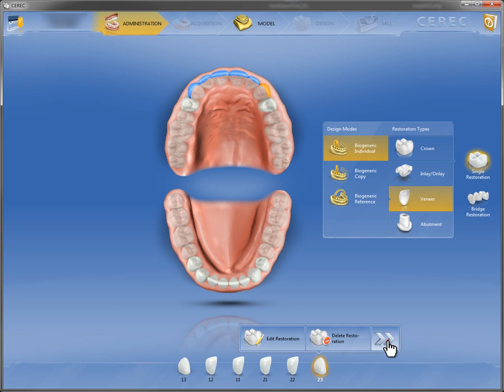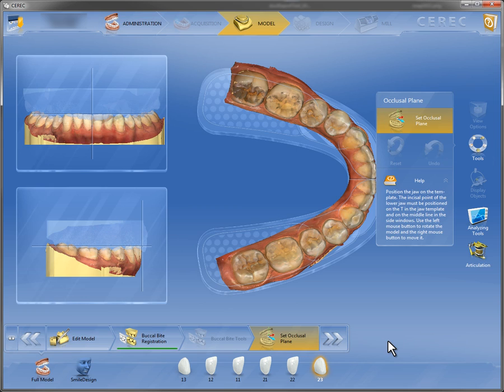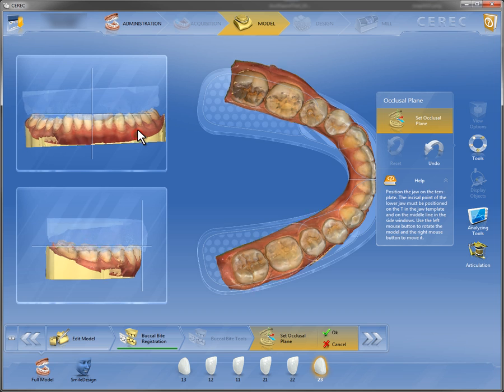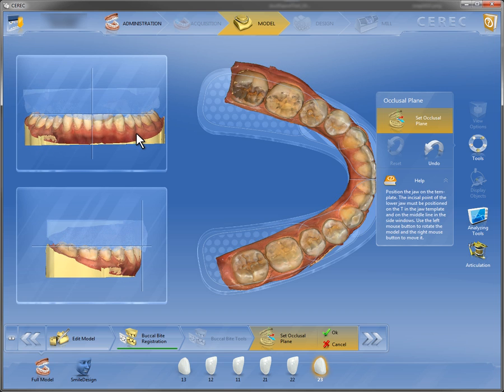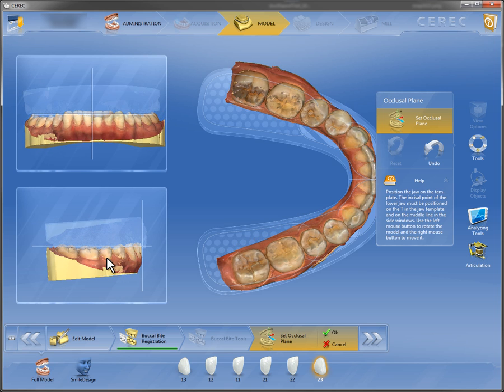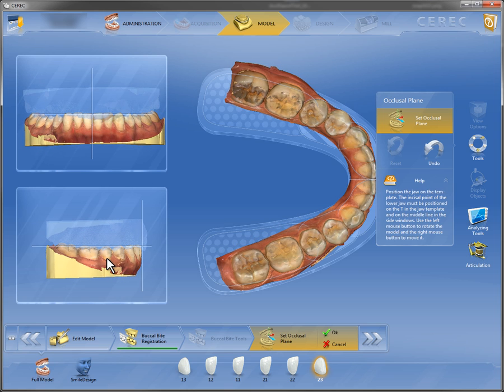Here we are going to demonstrate the feature smile design in CEREC 4.2. As usual, the preparation is scanned in and is aligned either horizontally or sagittally in the dialogue occlusal plane.